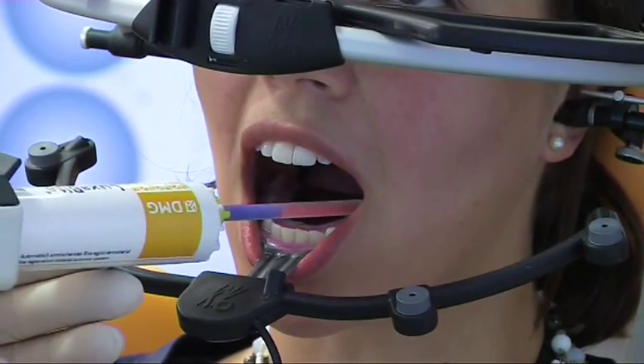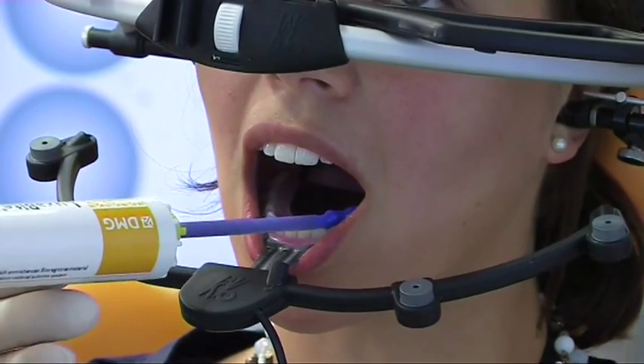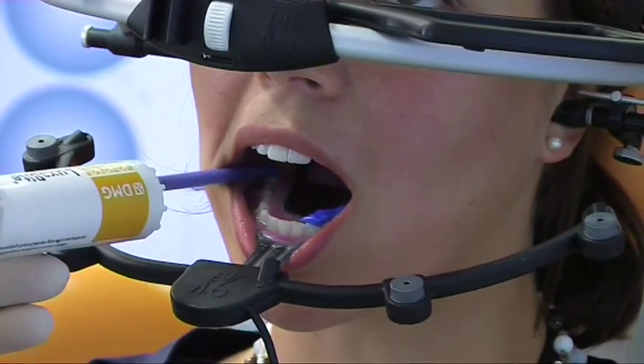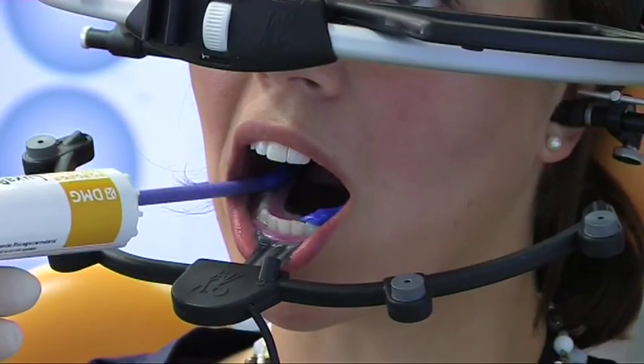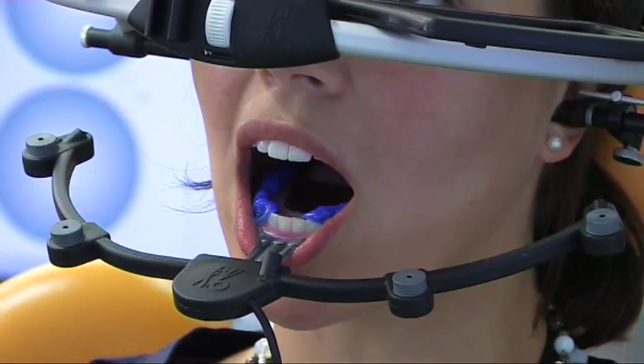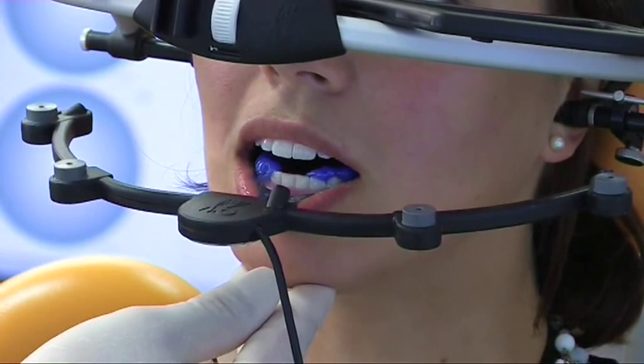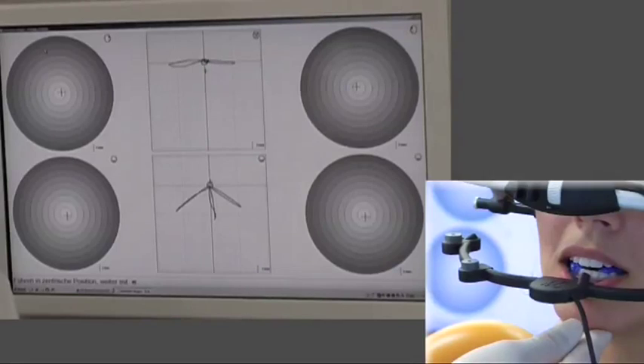Now a centric registration using registration material will be prepared. The material is spread over both sides of the lower dentition. Now please close and move the lower jaw slightly forward and then back.